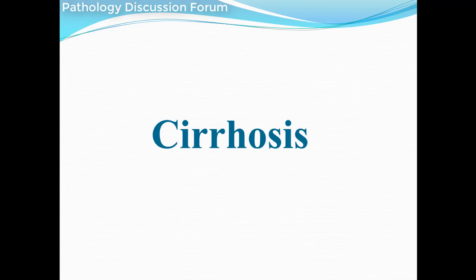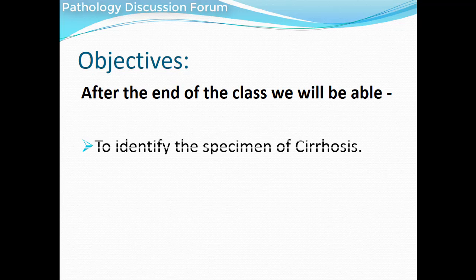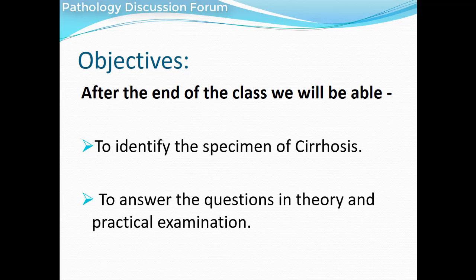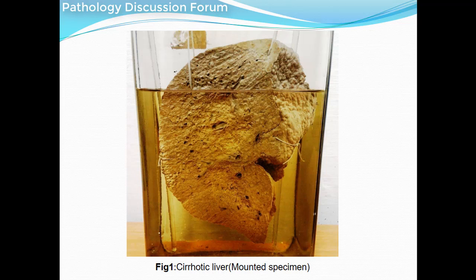Now, why cirrhosis? Because after the end of the session, we will be able to identify the specimen of cirrhosis. Also, we will be able to answer the questions in the theory and practical examinations. Along with that, we will acquire knowledge about the microscopic features of cirrhosis.